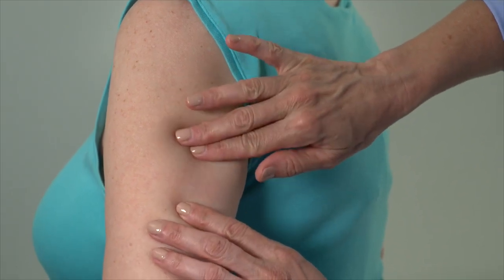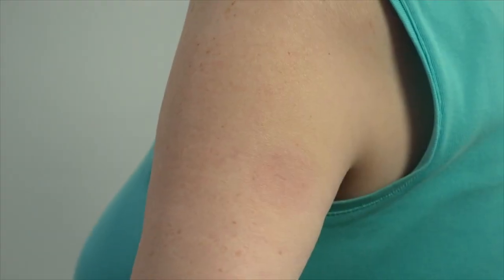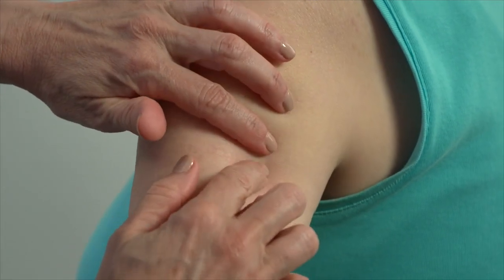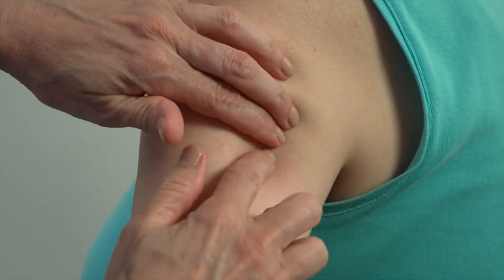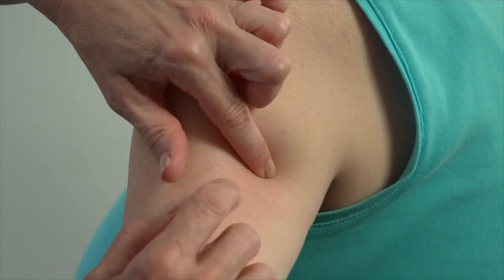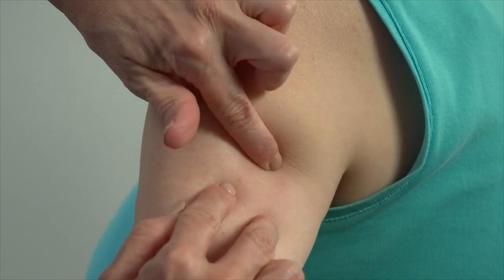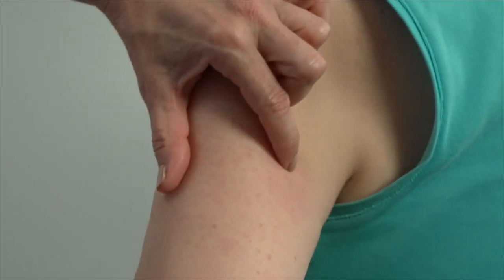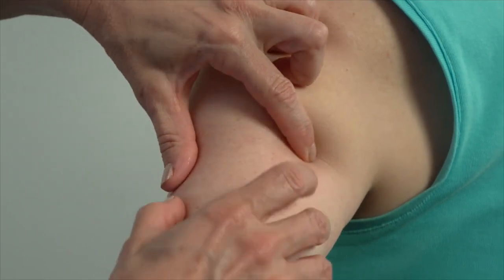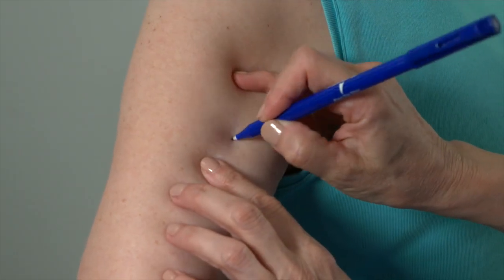Use your senses of sight and touch to locate the sensor. The following tips may help. Look for the original incision line and then palpate above it to locate the sensor. Or use your index fingers or thumbs to gently press on the skin at the sensor's expected site to locate it. It may be helpful to close your eyes and use a sliding motion over the expected location. This may enhance your sense of touch and help you identify the sensor's location. Also, have the patient flex the triceps and rotate the arm to help you locate the sensor. Once identified, use your surgical marker to trace around the sensor's location.